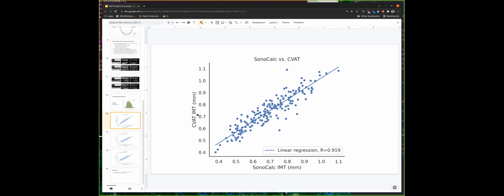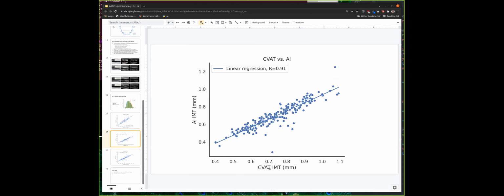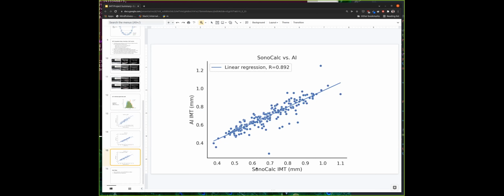This is the Sonocalc versus CVAT, so basically just measuring a difference in the drawing tools. Here is how well the model trained on CVAT would reproduce that kind of drawing. And yeah, I was looking into these, and these are just very low contrast images that confuse the model. Another way to deal with this is, just like you're doing, to get multiple examples of images for the same patient, and then it's pretty easy to see if there's an outlier across the measurements. And then here, the Sonocalc versus AI, probably the most interesting one, also very good agreement. And we can pull up examples of these where we have low contrast, where the model got confused.